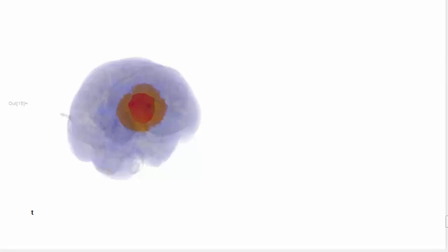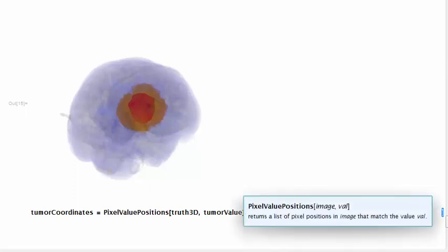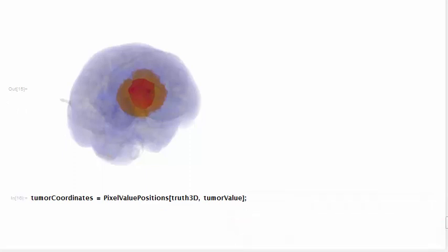In order to perform box counting, we need to isolate the tumor first. To isolate the tumor, we look into its coordinates in the truth file using the known gray value for tumor. We're going to use these tumor coordinates to create a new volume.